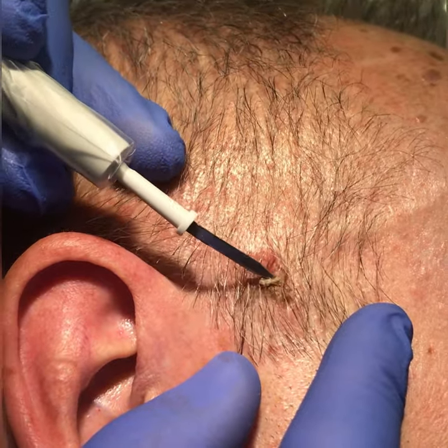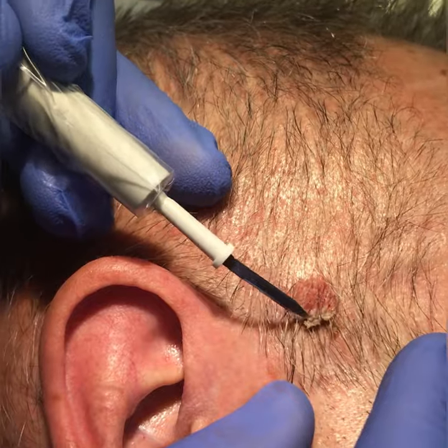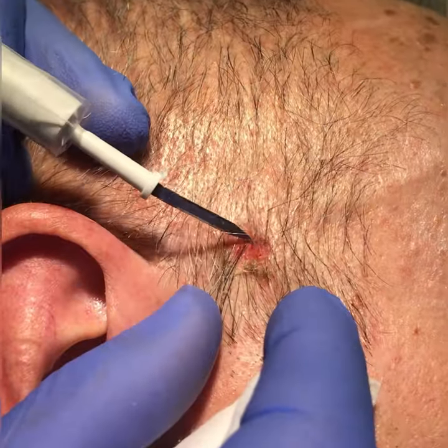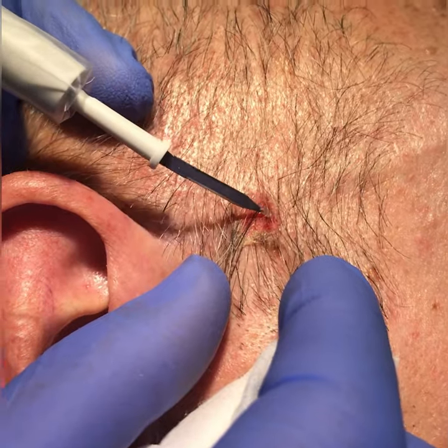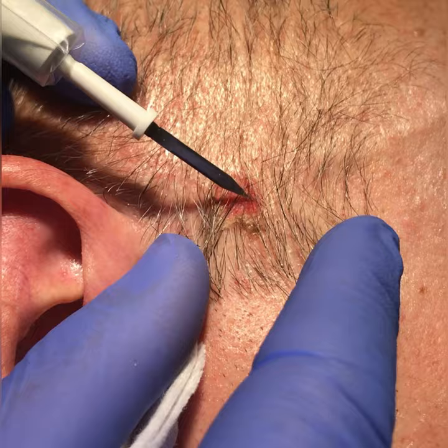The nice thing about this is that it's a radiosurgical procedure, just done under local anesthetic. As you can see, the wart is just fried off essentially, and then the base is literally cauterized and sealed over afterwards.